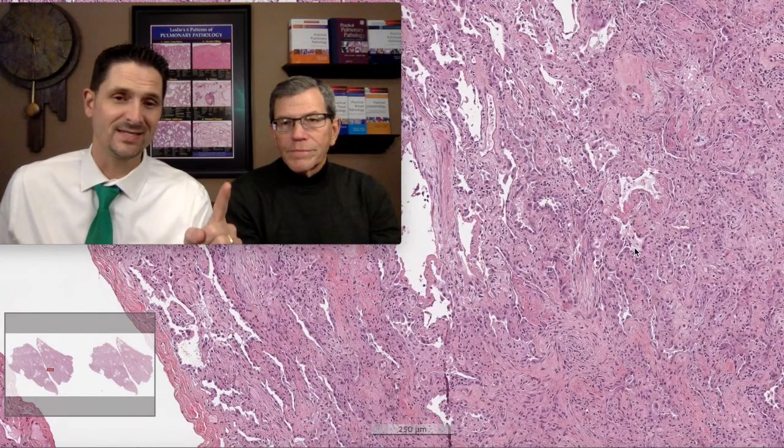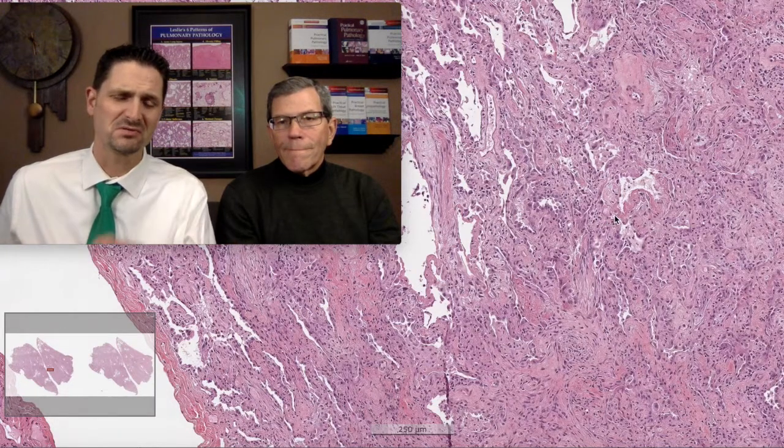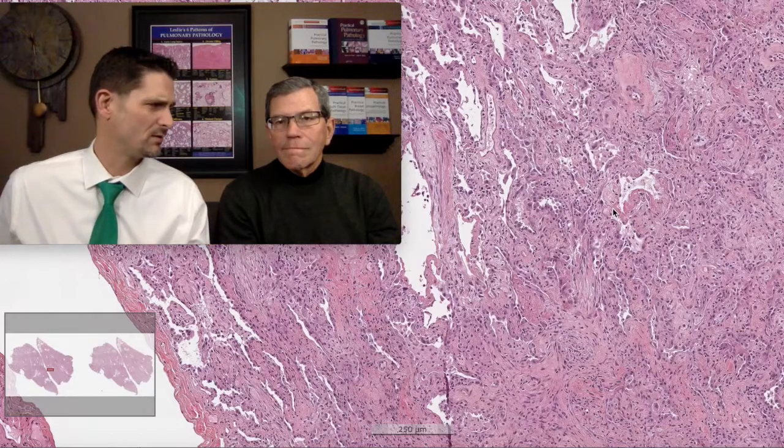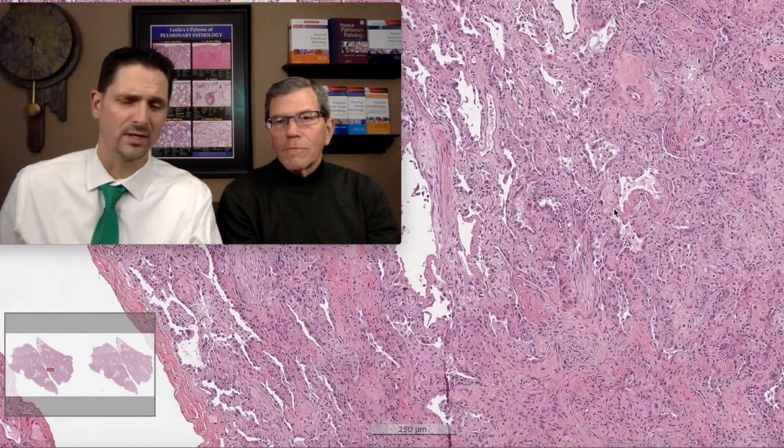Number one — C: connective tissue disease. What might you look for? Lymphoplasmacytic infiltrates in the interstitium, chronic pleuritis, follicular bronchiolitis. These are the things you'd look for for connective tissue disease. We don't really have that in this case; there's a little sprinkling of inflammation, but it's not out of proportion to the degree of acute lung injury.